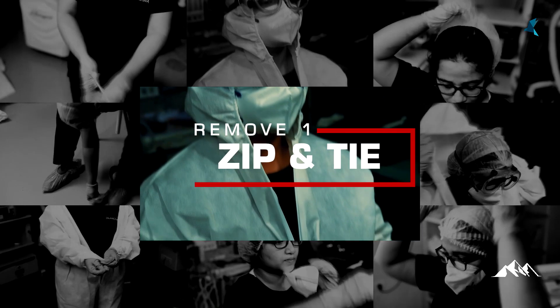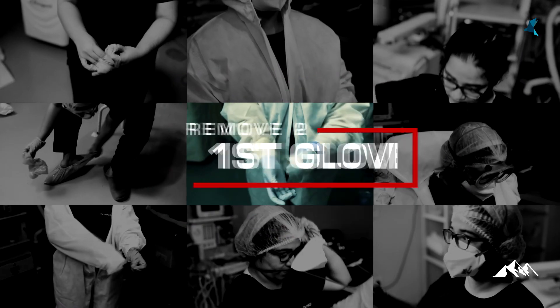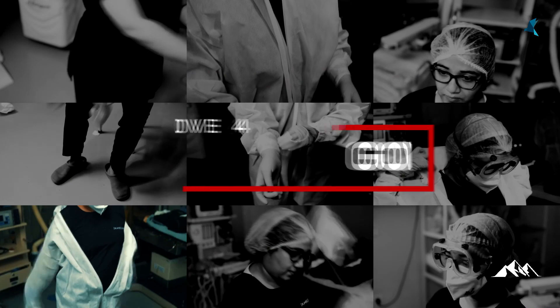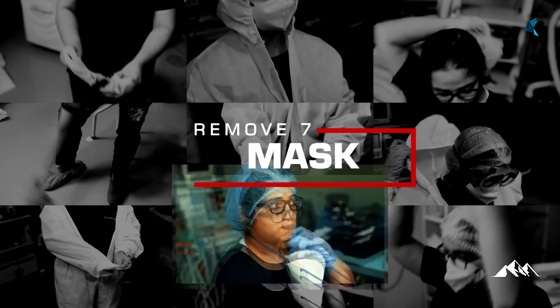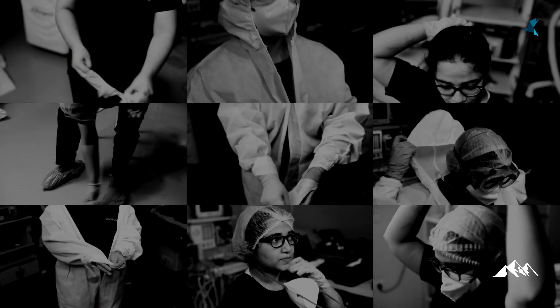Step 1: unzip and loosen the gown tie. Step 2: remove the outer or top glove. Step 3: remove the hood. Step 4: remove the gown. Step 5: remove the shoe covers. Step 6: remove the goggles. Step 7: remove the respiratory mask. Step 8: remove the head caps. Step 9: remove the innermost glove and perform hand hygiene.